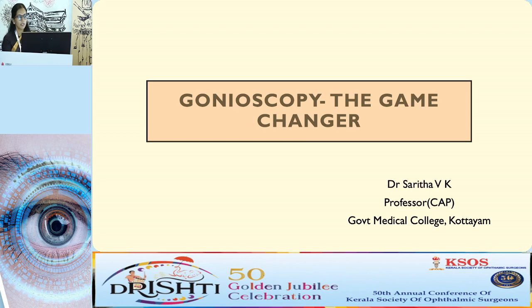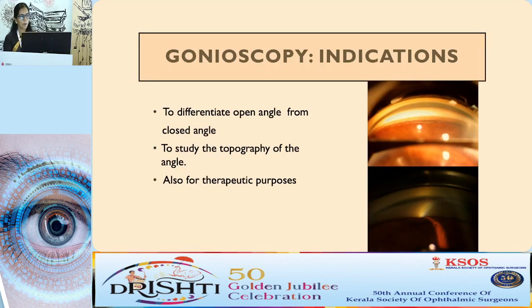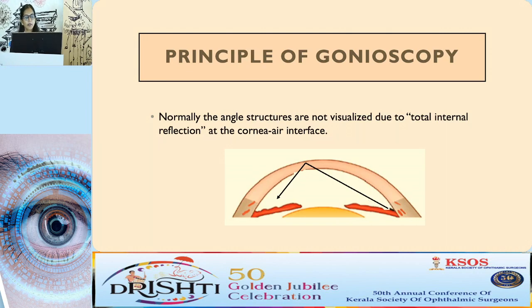The topic is gonioscopy. Straight away coming to the indications. Basically, it is to differentiate an open angle from a closed angle and to study the topography of the angle, and also used for therapeutic purposes. A word about the principle.